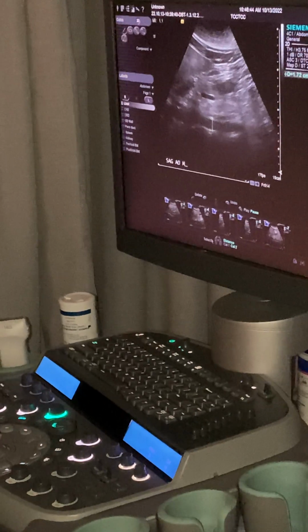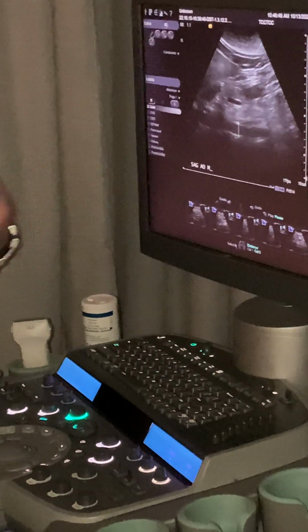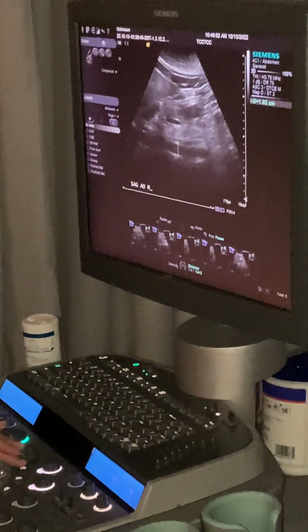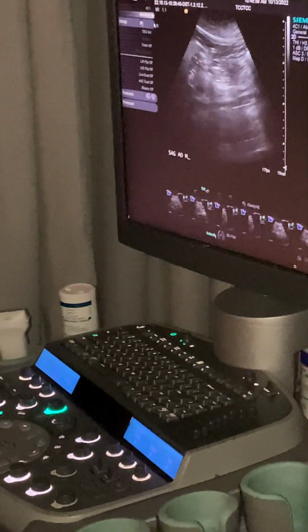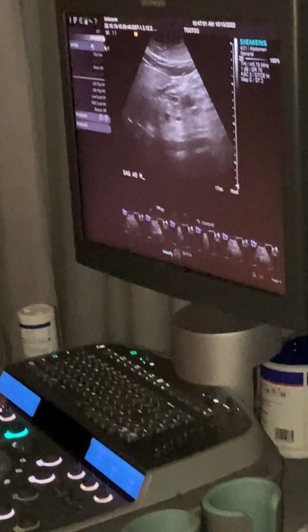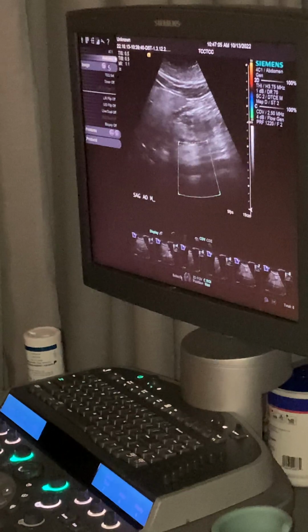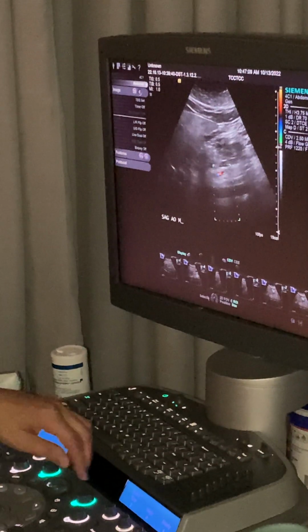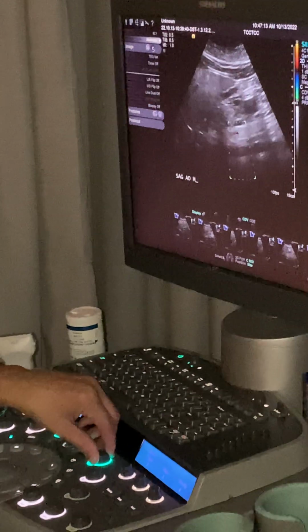So would you take it just past the liver? If you couldn't see pancreas, yeah, just kind of the middle of the neighborhood. So there's our Sag AO mid. And what's next? Color. Okay, go ahead and pick one. Hold on. Okay, so let's see if our color friends are working out today. Yeah, these machines just really suck. Let's go color cleanup.